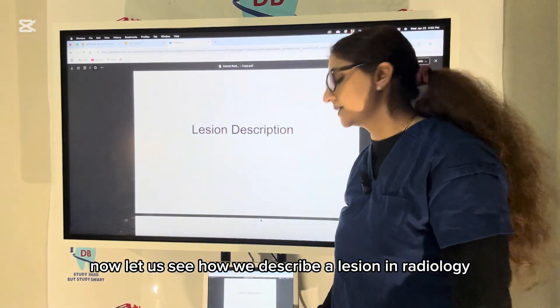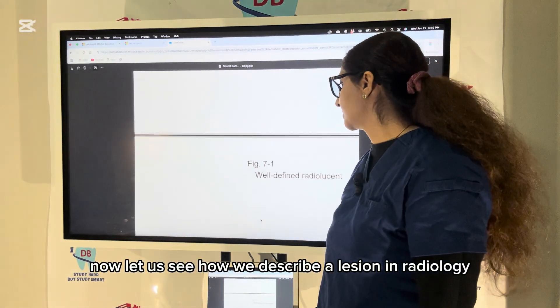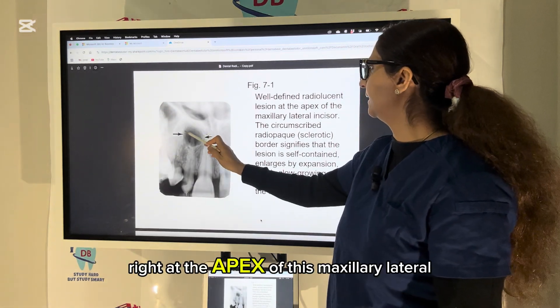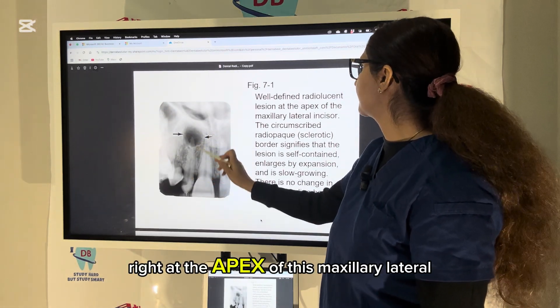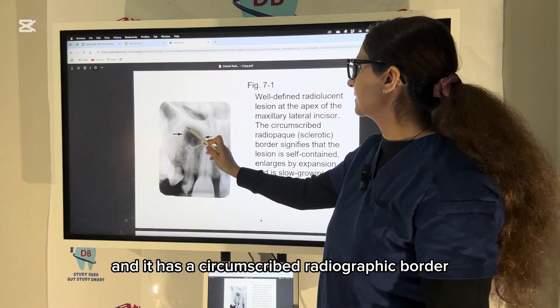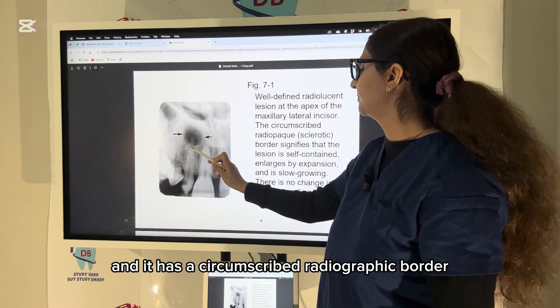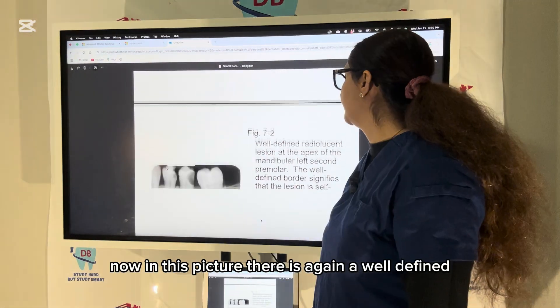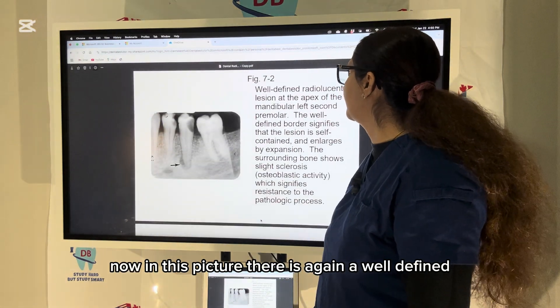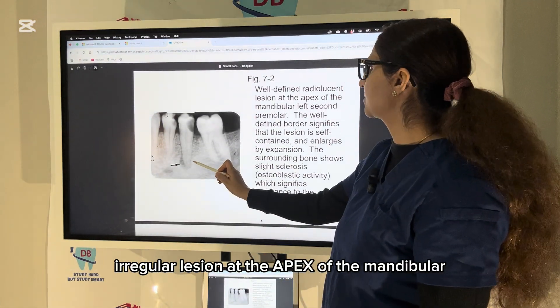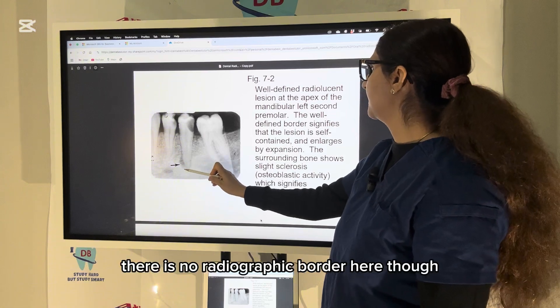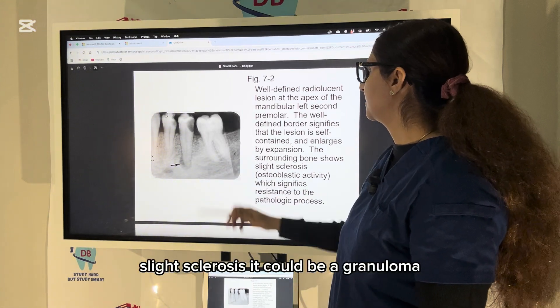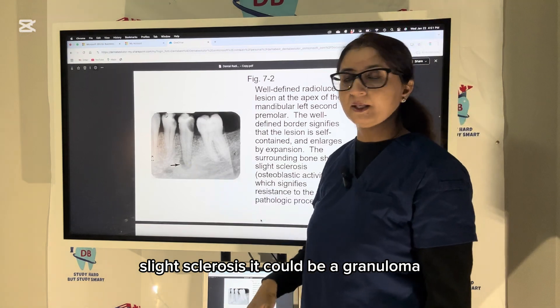Now let us see how we describe a lesion in radiology. If a lesion is well-defined at the apex of this maxillary lateral and it has a circumscribed radiopaque border and is slow-growing, this could be a cystic lesion. In this picture, there is again a well-defined radiolucent lesion at the apex of the mandibular left second premolar; there is no radiopaque border here, though slight sclerosis — it could be a granuloma.